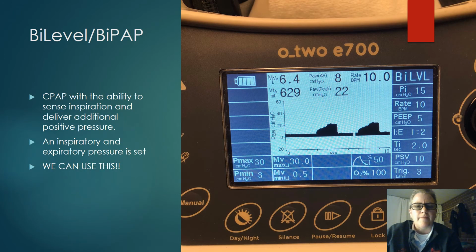Okay, let's talk about BiPAP bilevel. Hey, we can use this. It has been approved by the EMS Physician Commission that we as just regular paramedics can use this bilevel support. So we can use this now on our ventilator. So exciting. So it's like CPAP with that pressure support. So an inspiratory and expiratory pressure is set just like that CPAP with the pressure support ventilation.